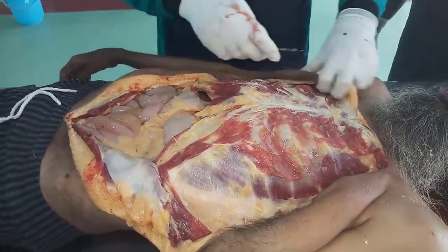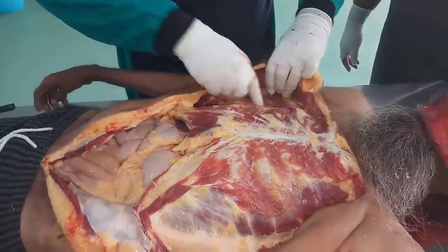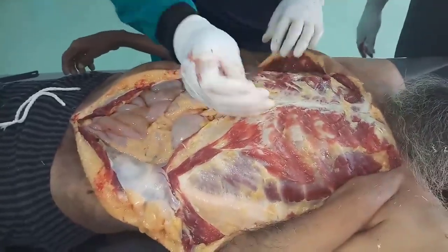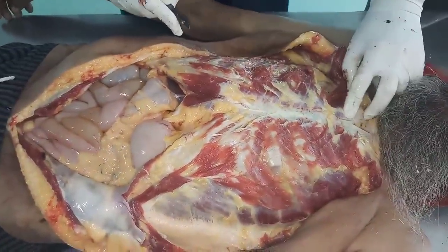This I have done for the other side. Again we will extend this incision from here for easy dissection. So now you can see the ribs, costal cartilage. We'll just identify some landmarks.